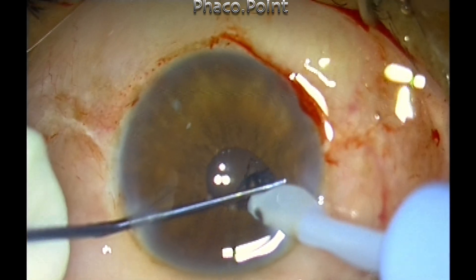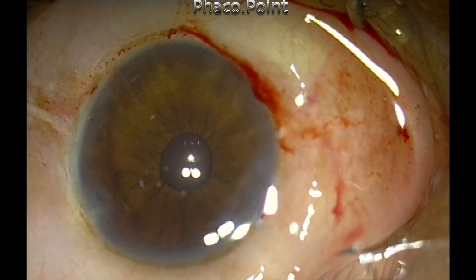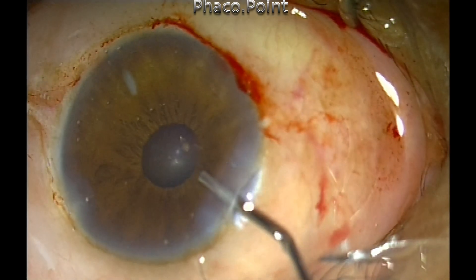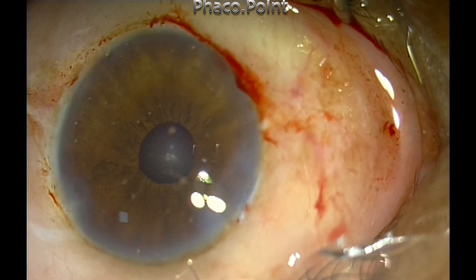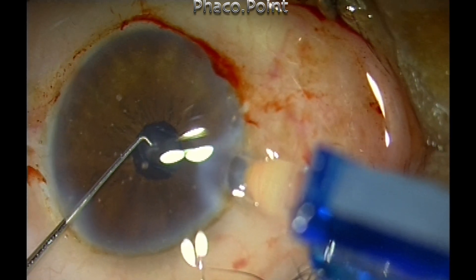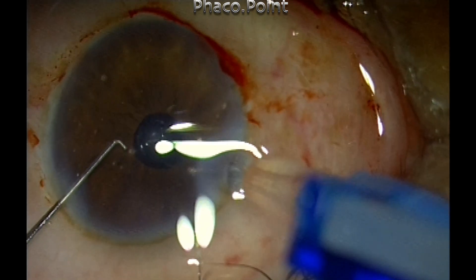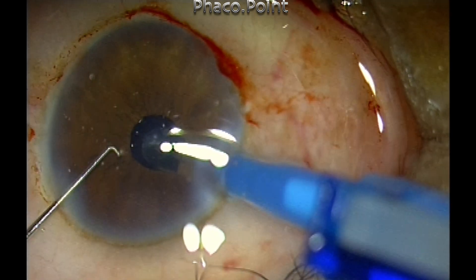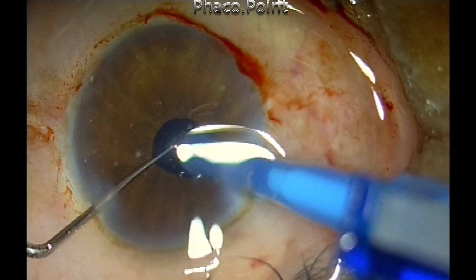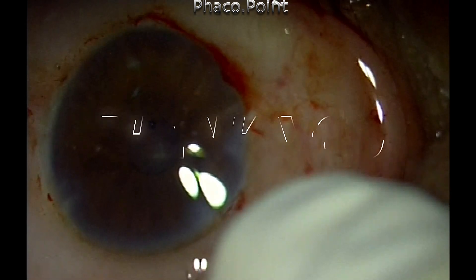For the implantation of the intraocular lens, I am using a technique to deliver the lens in a single shot within the capsular bag. I carry the cartridge bevel right up to the inner circle so the bevel is in the center of the pupil. As you inject and the lens gets delivered, you just push the trailing haptic as it emerges from the cartridge into the capsular bag. In nine out of ten cases you will succeed in getting the lens into the capsular bag with this maneuver. Thank you for your attention.